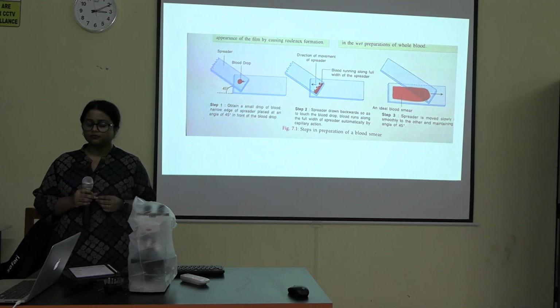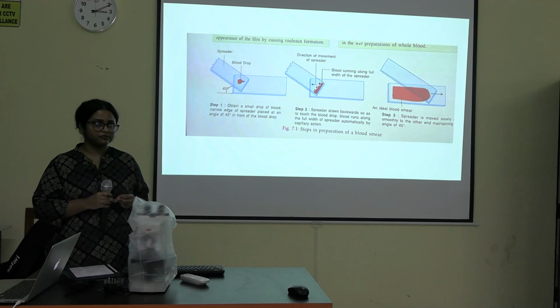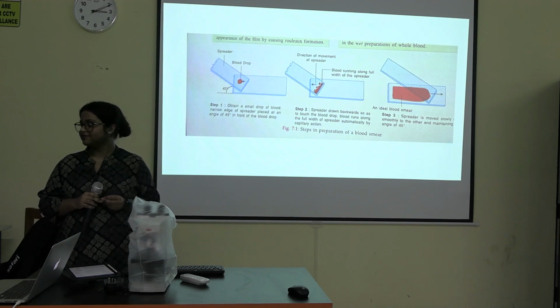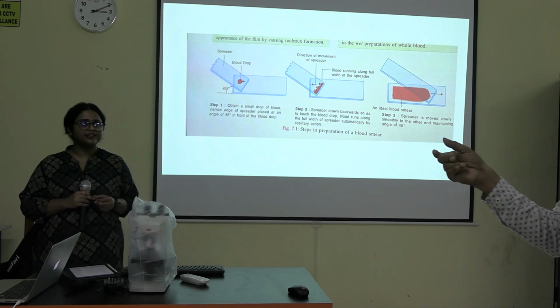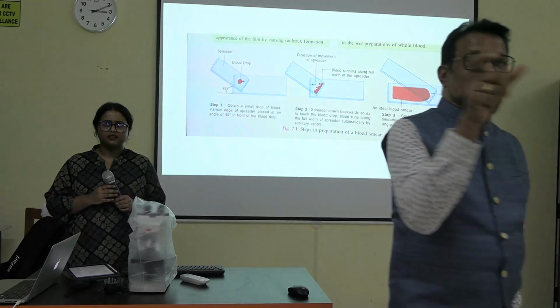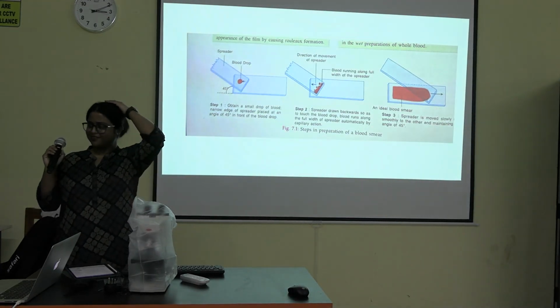The components which are negatively charged, what do we call them? Acidic. So negatively charged is acidic and positively charged is basic. Actually these are acidic.